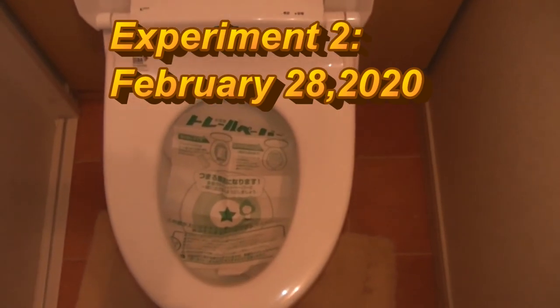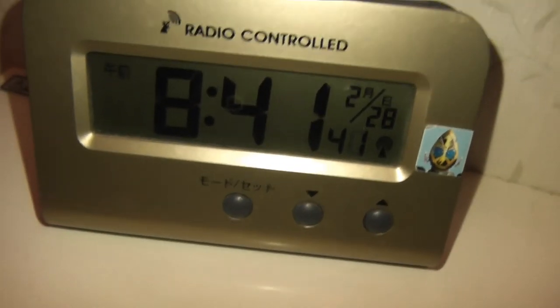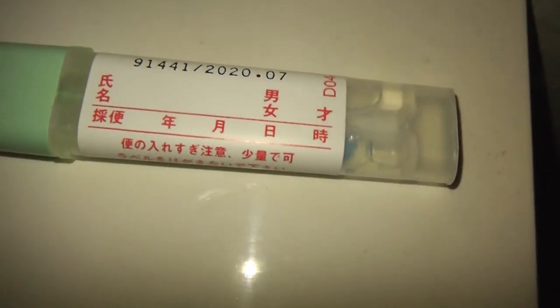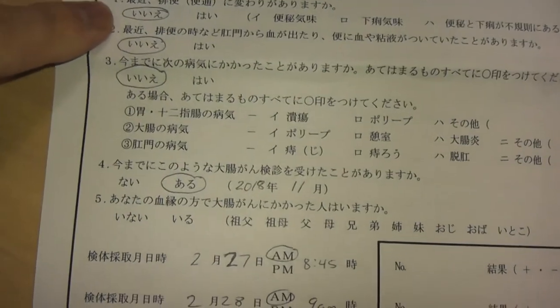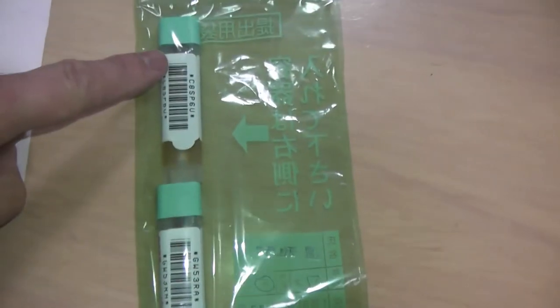Hi everyone — it's day two, February 28th, 2020. I'm doing the same thing. Got my layers of toilet paper. The time is 8:41. Here is vial number two. Here is my completed form with both experiments on it, and here are my two vials in the green bag.